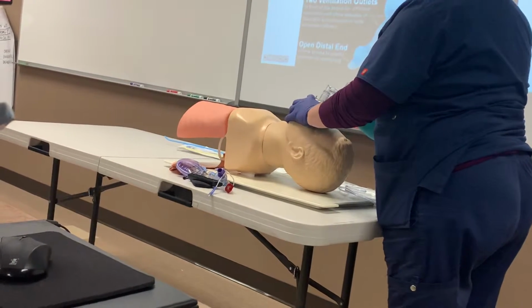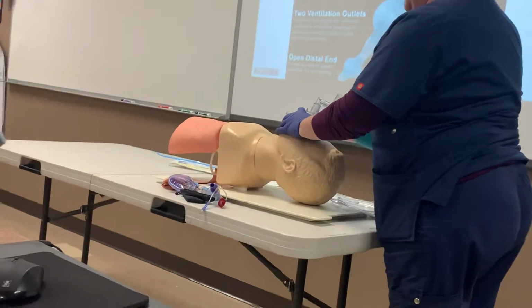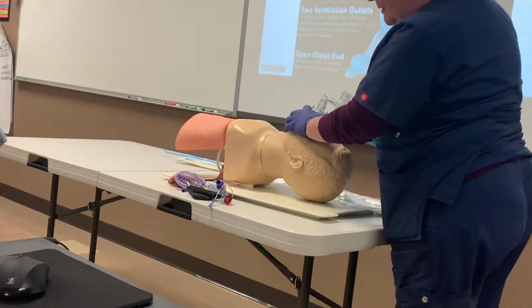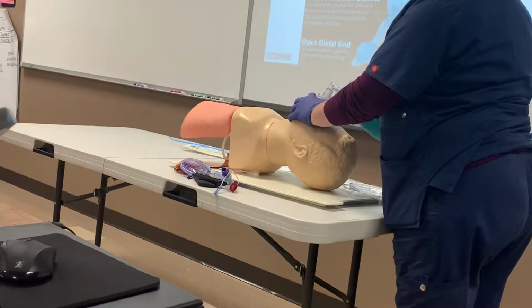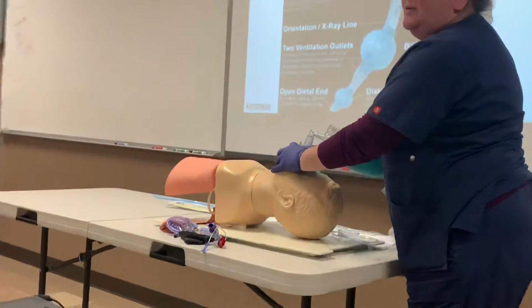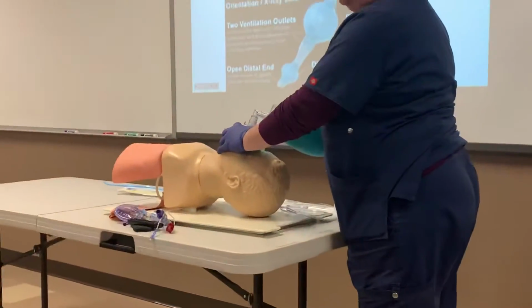It is. This set of lungs is not working very well, but I am actually ventilating the patient properly. 1, 2, 3. But right now, I'm able to do this. But the patient's not paralyzed.